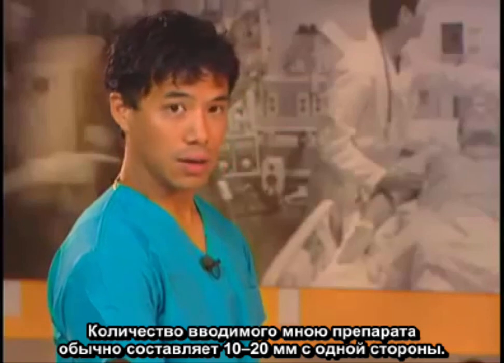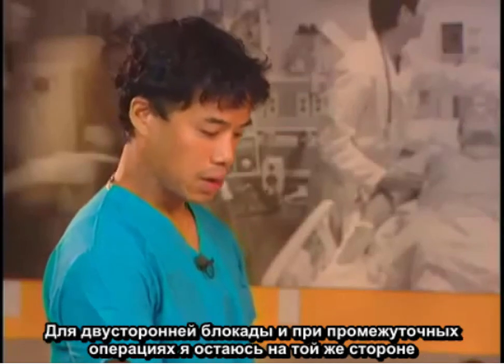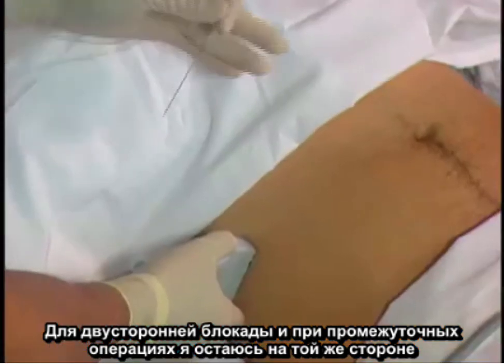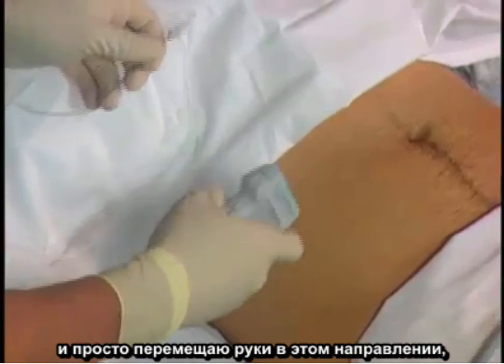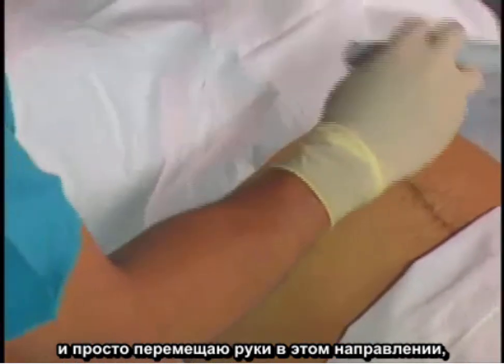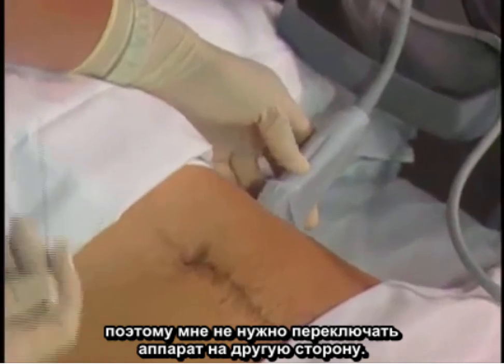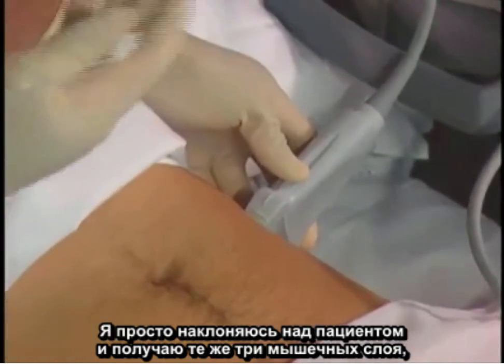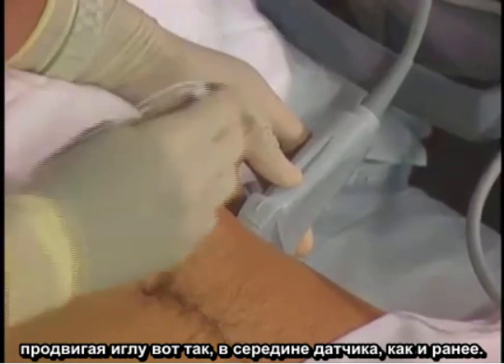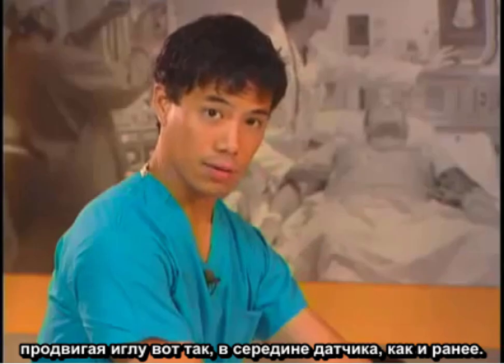The volumes I usually inject here are 10 to 20 milliliters on one side. For bilateral blocks for midline surgeries, I'll stay on the same side and just move my hands over in this direction, so I don't need to switch the machine to the other side. I'll just lean over the patient, get the same three muscle layers, and advance the needle like this in the middle of the probe, just like previously.